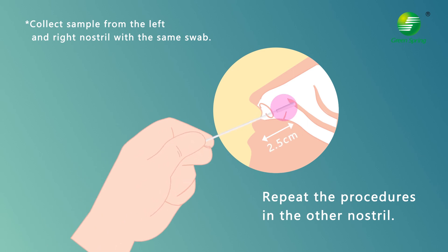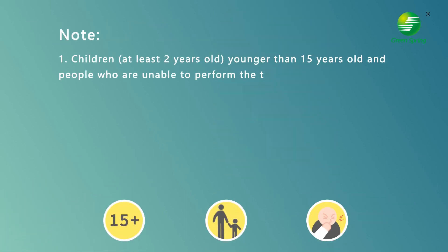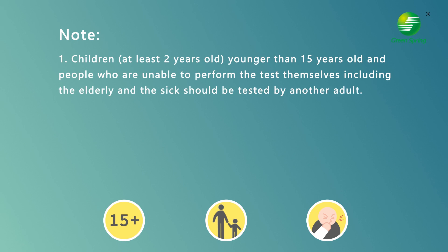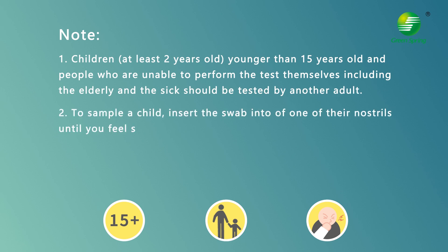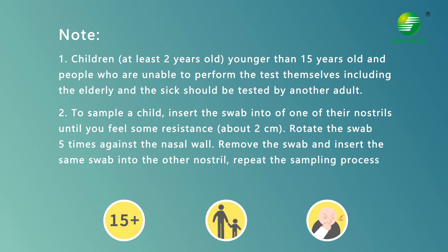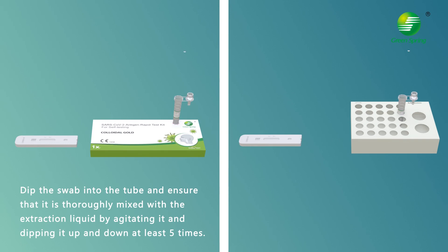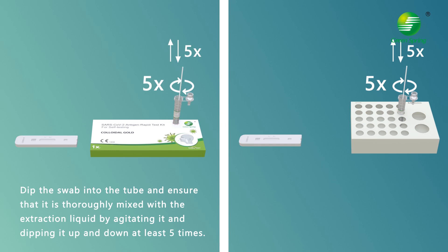Note: children aged 2 to 15 should be tested by another adult. To dilute the sample, dip the swab into the tube and ensure it is thoroughly mixed with the extraction liquid by agitating it and dipping it up and down at least five times.